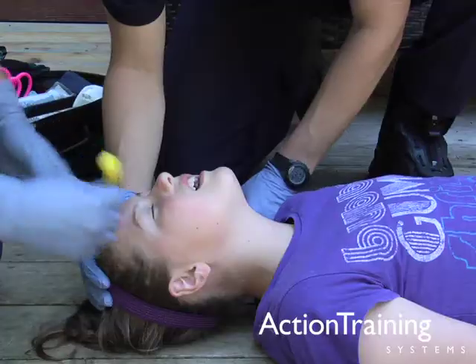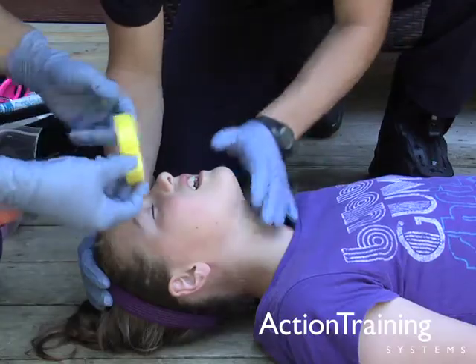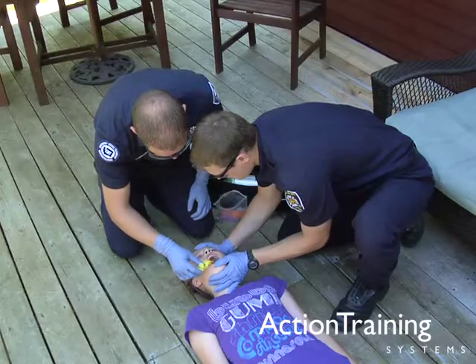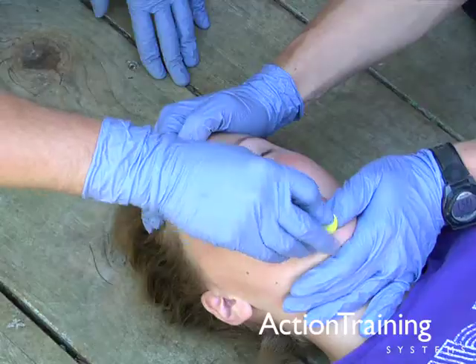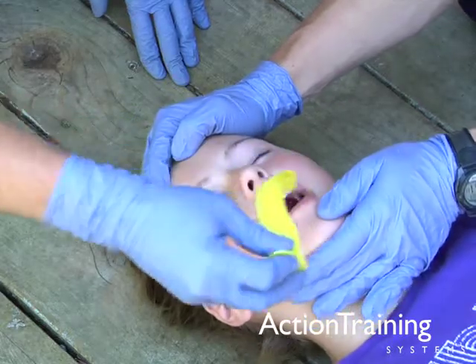You have seen how to assure a patent airway using the oropharyngeal airway, including what it does, how to insert it, and what to do if the patient has a gag reflex.